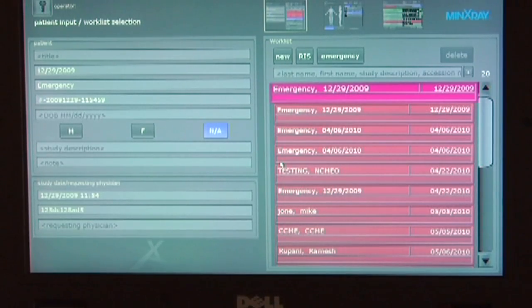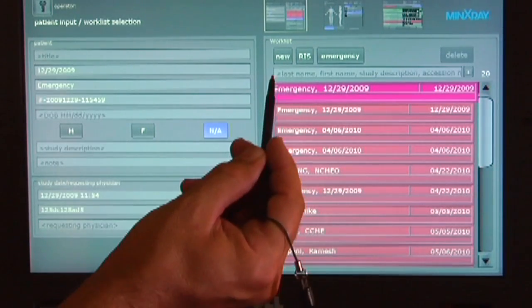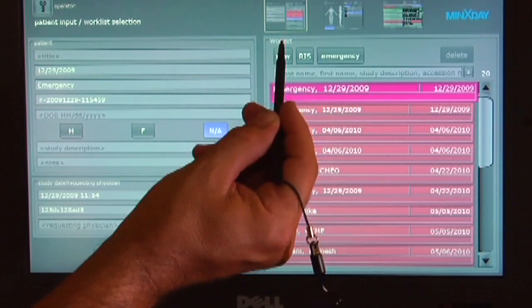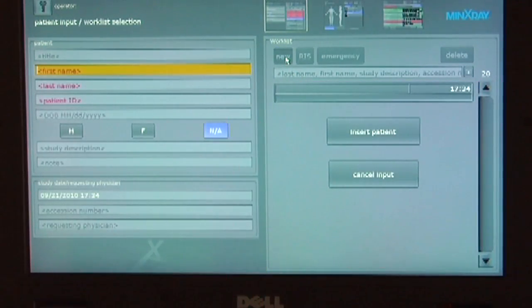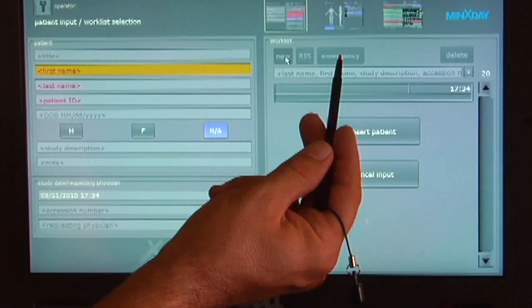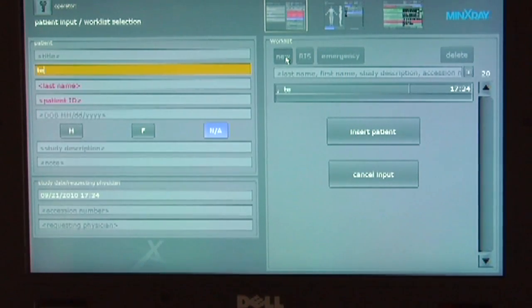Input patient demographics using the patient tab located in the upper right corner of the screen. Minimum fields to be populated are seen in red. The emergency tab can be used when no patient demographics are supplied.